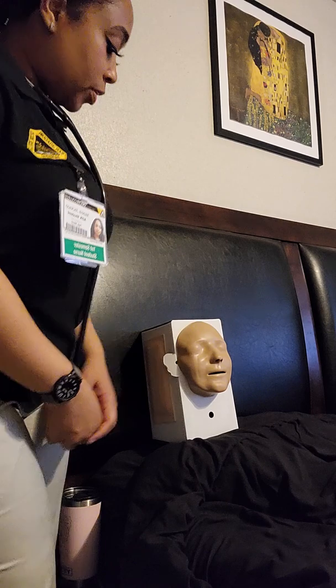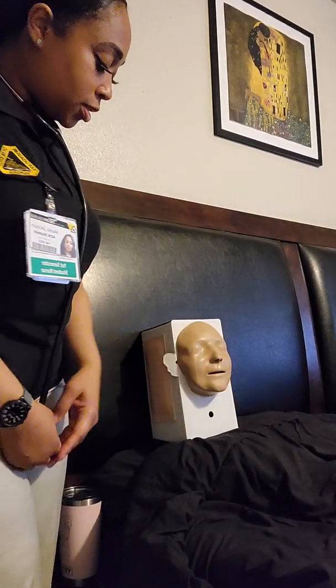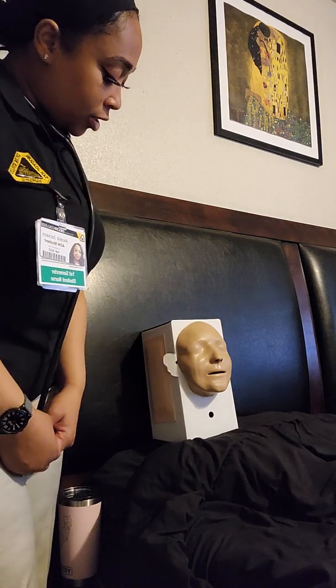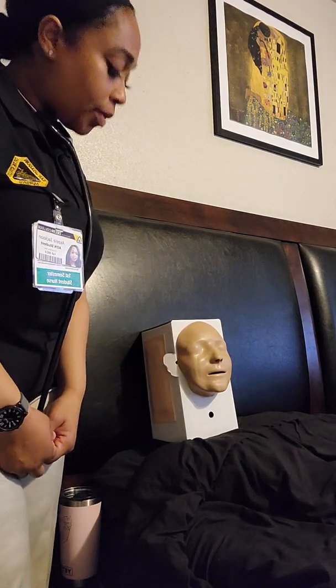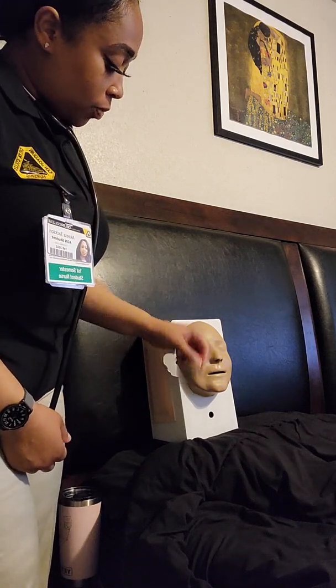So I will be inserting an NG tube. I know that the doctor came in and spoke with you about this due to your bowel obstruction. Have you ever had an NG tube insertion? No? Okay. So what I will do is I'm going to insert a tube into one of your nostrils.